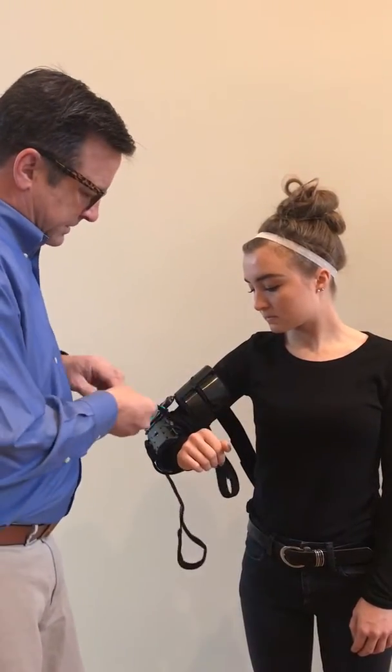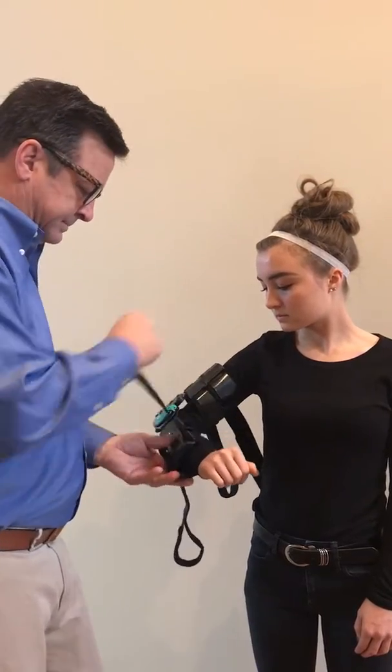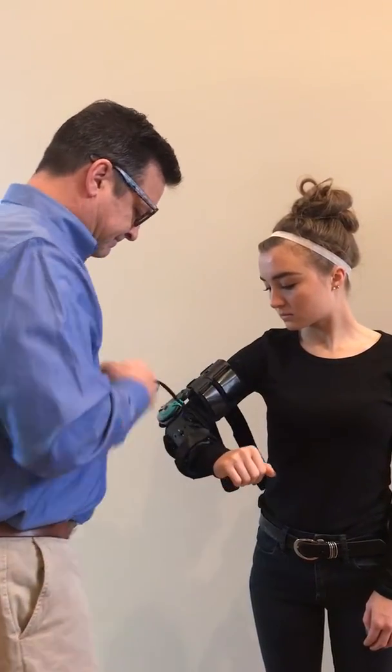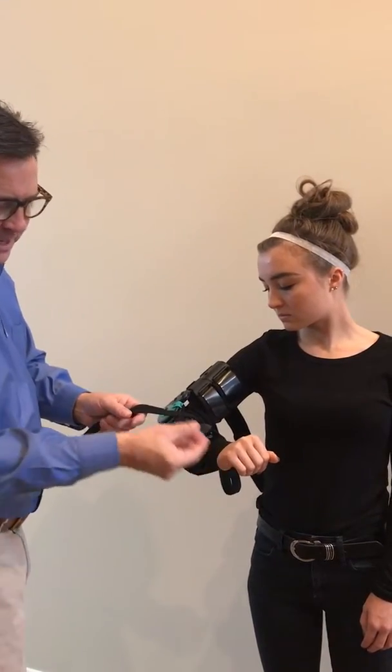Start with the first strap down low, pull it through its D-ring, and close it down. Do that for all the straps. You can adjust the length by pressing this button and it slides in and out.